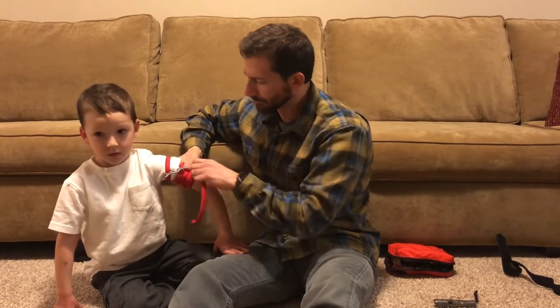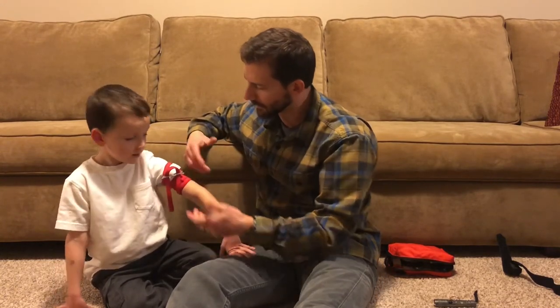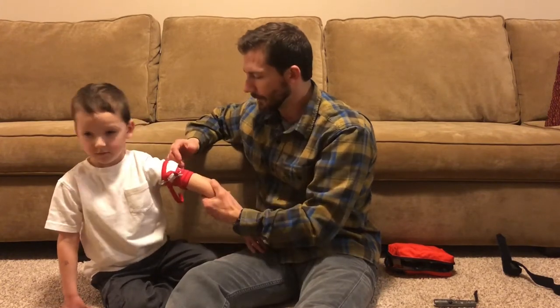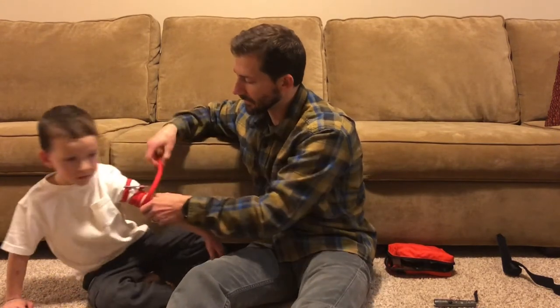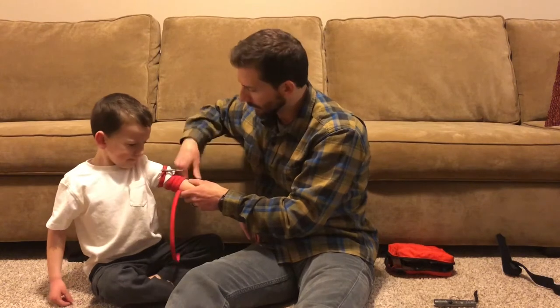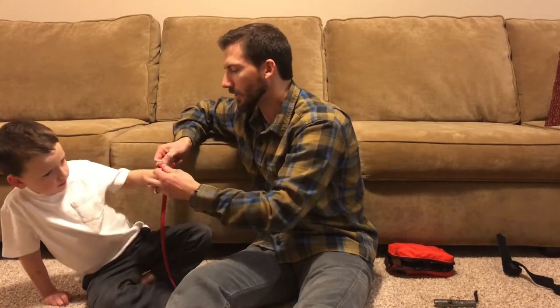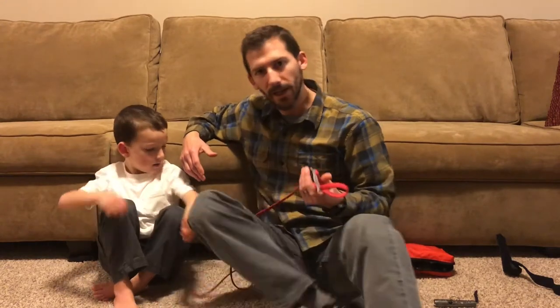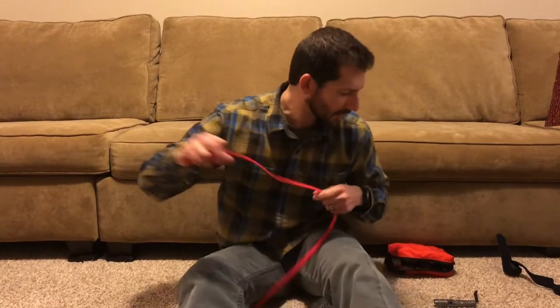Coach your patients — tell them what you're doing. To secure it, bring it back through one of these retaining clips and double it down on the other side as well to make sure it won't move. You want tourniquet material that's about an inch and a half to two inches wide. The RATS is only about a half inch wide, but if you loop it over itself two to three wraps you get the width needed to help prevent tissue damage. The RATS is a great choice if you have kids or, like me, you're on a church security team protecting several hundred kids every Sunday.